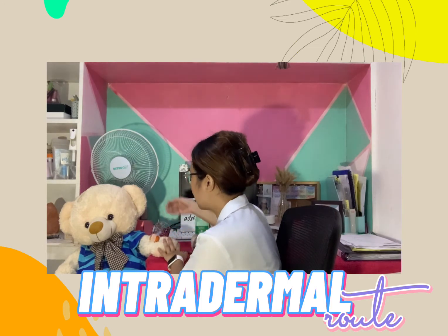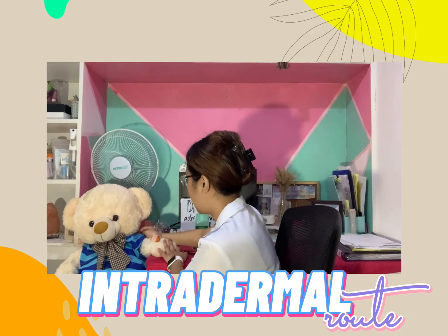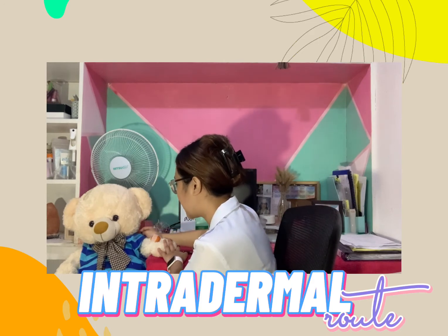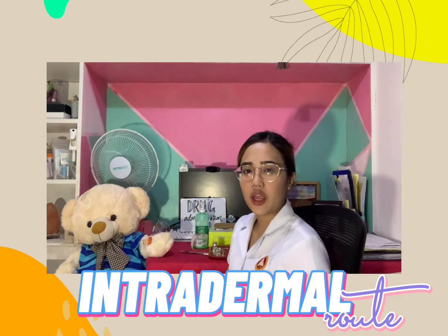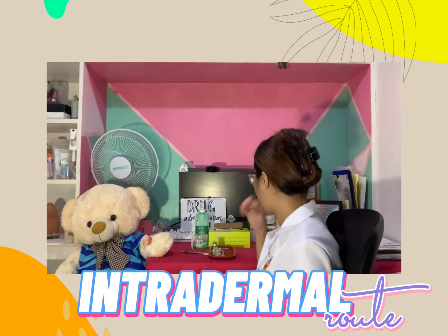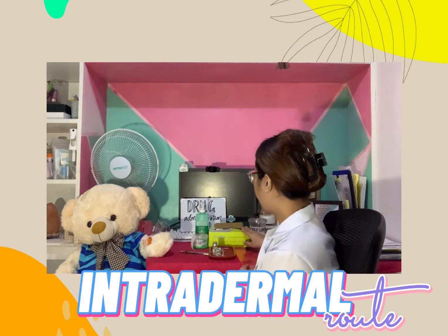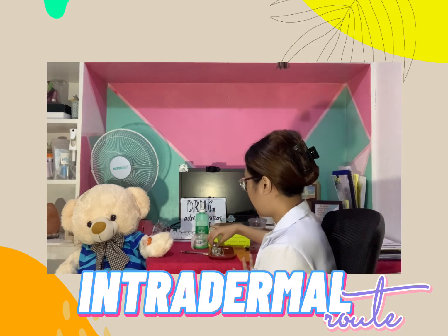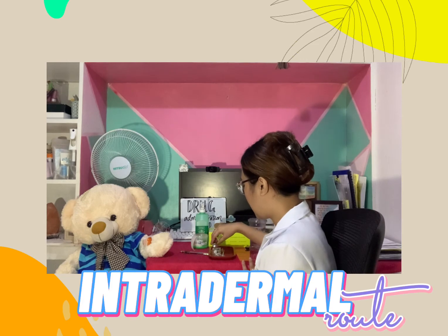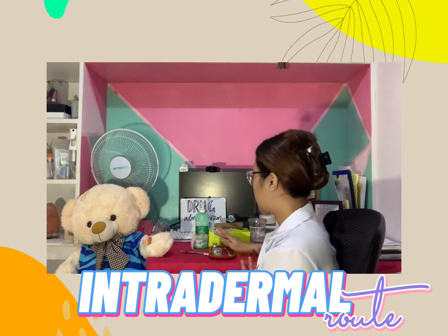So ma'am, we will perform a skin test po to assess po if you acquire any allergies to the medication to be administered on you po. Is that okay with you po? Okay po. So for the planning, we need to assemble all of the equipment to be used. We need to have our medication administration record, our gloves, our sharps container, dry and wet cotton balls, our 1 ml of sterile water, the ordered medication, syringe, filter needle, and the alcohol swab.